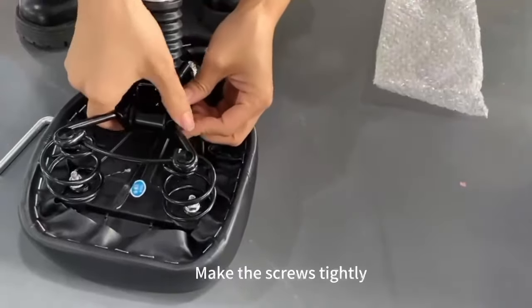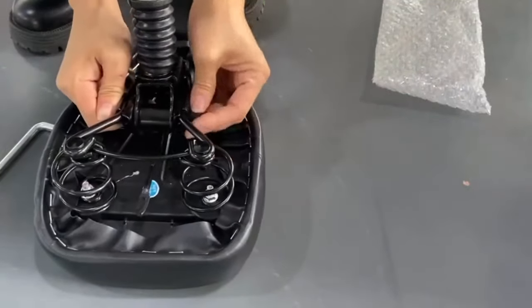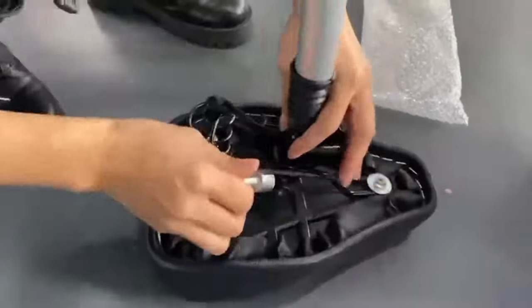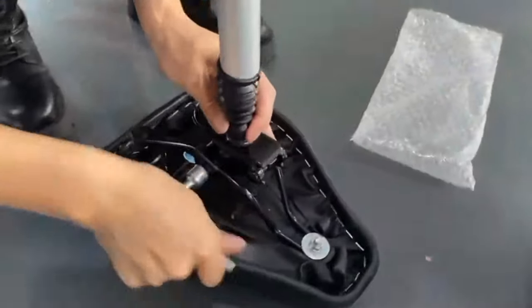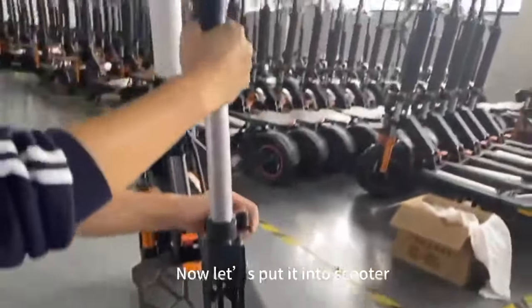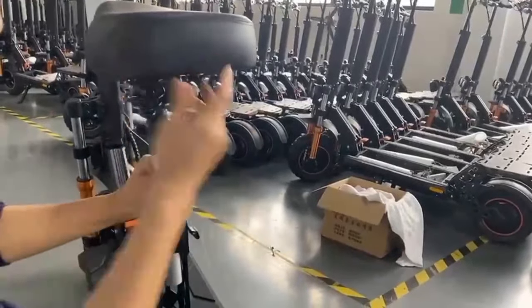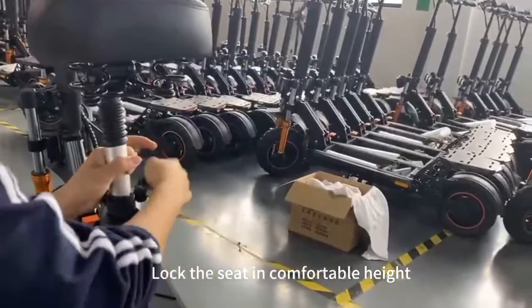Make the screws tightly. Now let us put it into the scooter. Lock the seat in comfortable height.